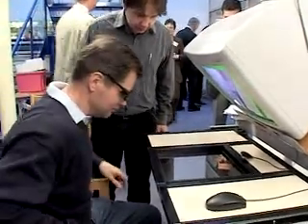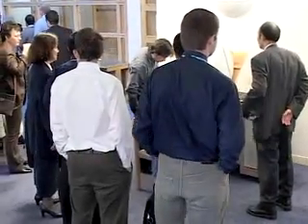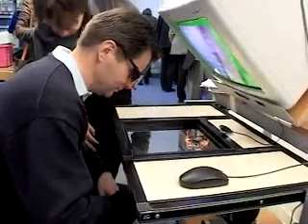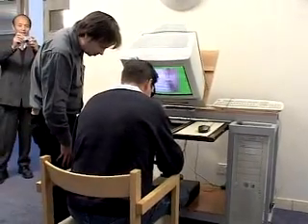This simulation of surgical cutting in real-time computing is particularly difficult to achieve. Cutting creates new surfaces that did not exist before the cut was made. Nottingham's researchers have devised new computational methods that allow the software to respond to the cut in real time.